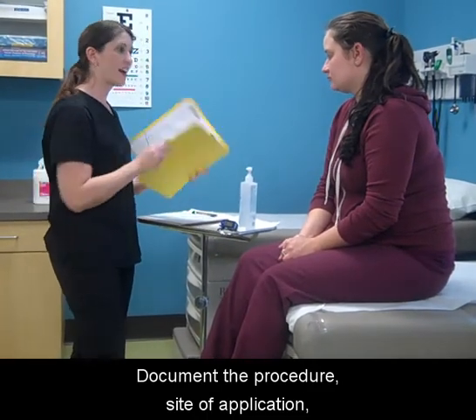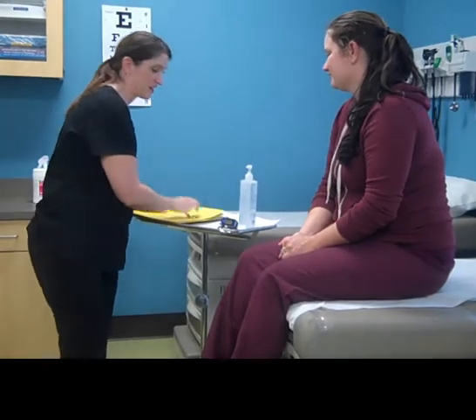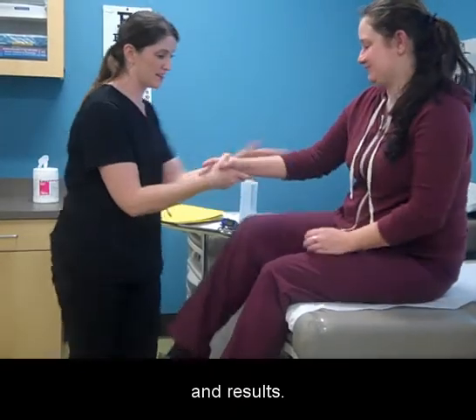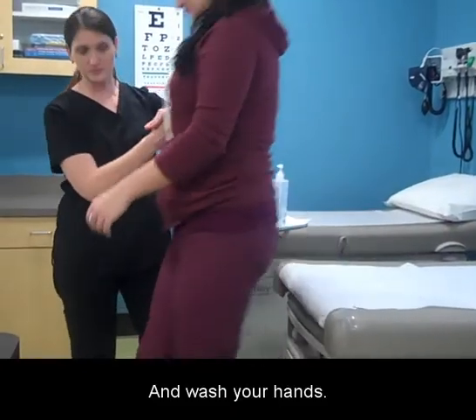Document the procedure, site of application, and results, and wash your hands.